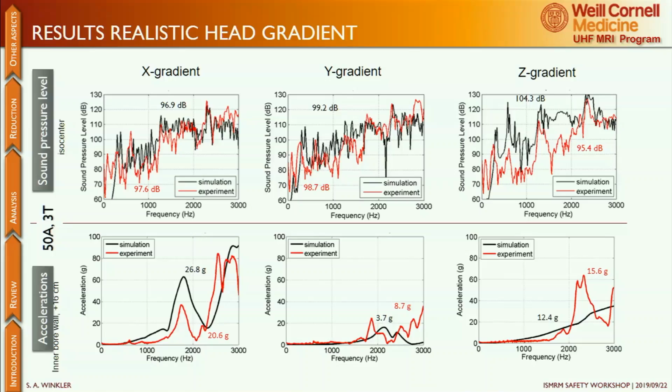Sorry, I didn't really understand. You said one of your statements was that the baseline sound pressure is determined by the resonant modes in the gradient coil, and that these individual little resonances, well, they can be quite high, but the peaks in the spectra are the acoustic modes. So I would assume if you modify the interface, as you suggested, of the two, that you can affect the coupling between these two. And in a way, I would always assume that should always be possible in the gradient design, so get rid of this partially disastrous coupling effect.